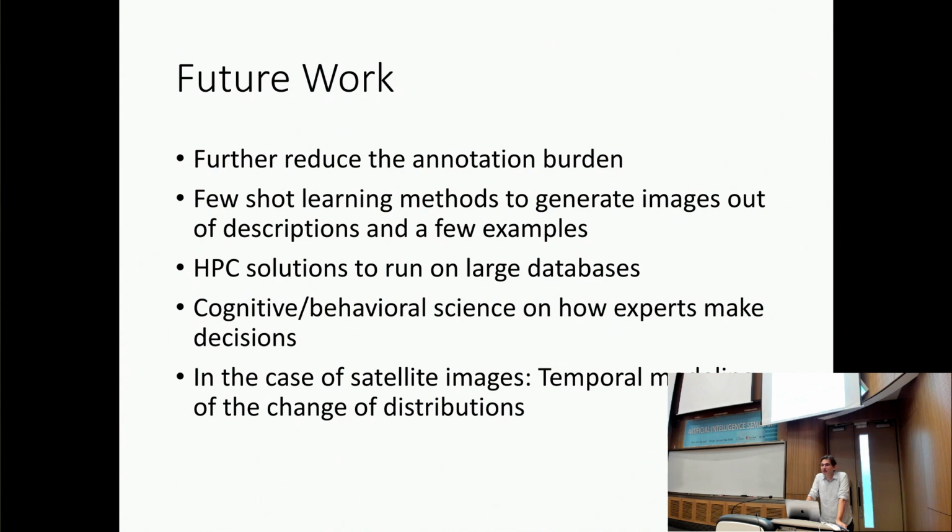Thanks for your talk. In your tumor classification work, do you take your patches to be overlapping like the general CNN patches or discrete non-overlapping ones? Well, we have tried everything, but we don't necessarily take all of the patches, because there are just too many. Then how many of those patches are positively labeled? None. This is the whole problem. All we know is that some pathologist looked at it and gave it a label.